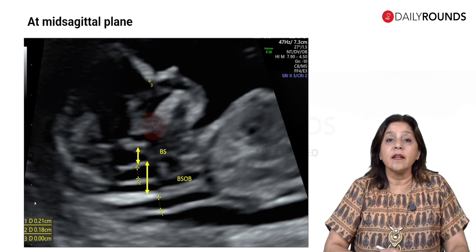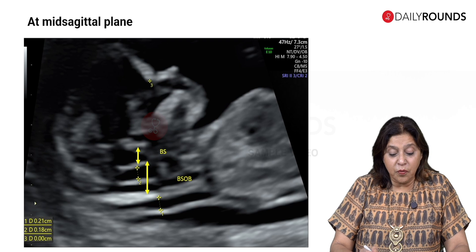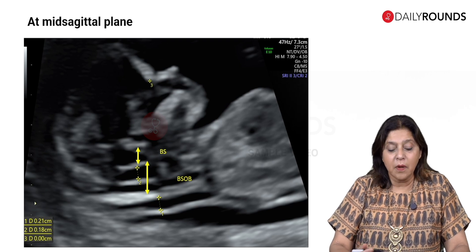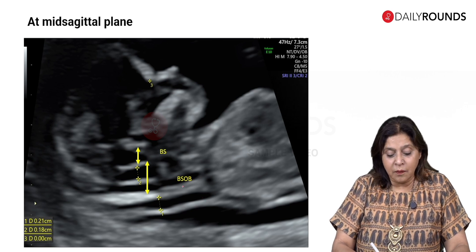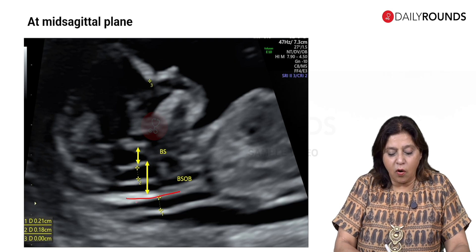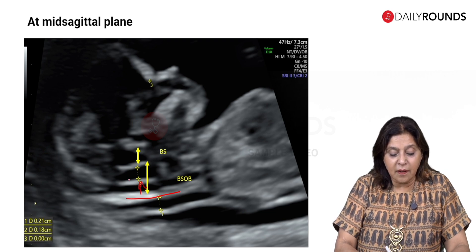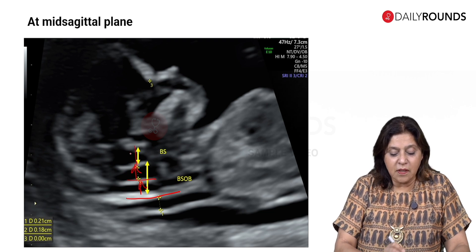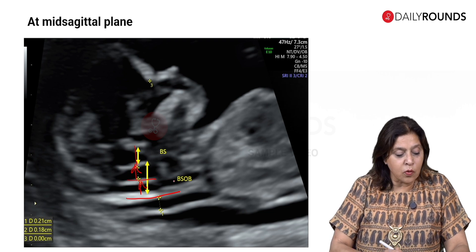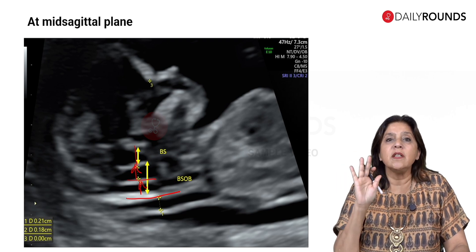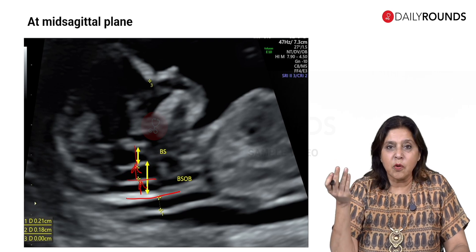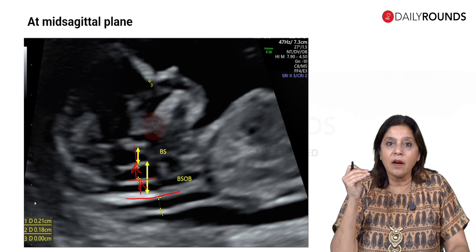This shows the same anatomy again. If you do reading, you'll find references to brain stem-to-occiput ratios. The occiput is the brightest structure; just above it is the cisterna magna, then the choroid, the fourth ventricle, and the brain stem. There will be times when you need to know the angles, but remember these three spaces and make sure you are familiar with them for your first trimester scans.